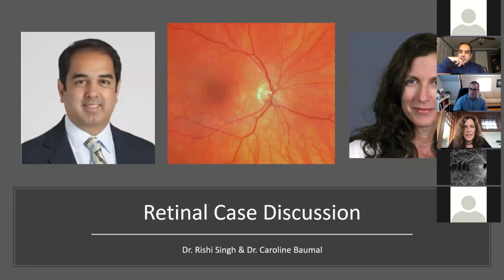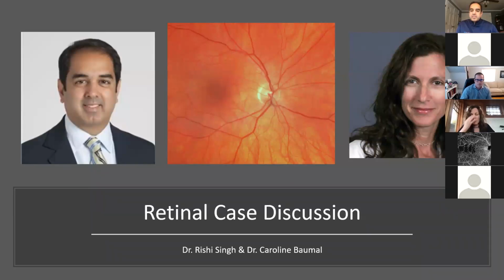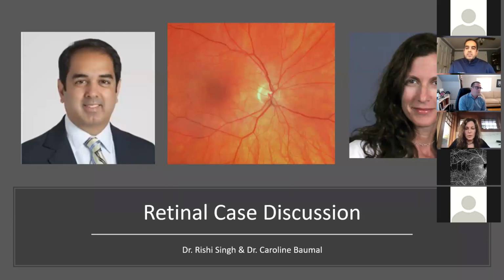Well, I think that we're definitely categorizing intraretinal and subretinal fluid differently, because that's a little bit easier to even tell just from looking. But I love the way that you looked at the sub-RPE fluid, Rishi, and I think that was great. And the one thing I really like about the way that you demonstrated in your talk, like with workplace, is that you can see the changes over time, because it's really easy to miss those small little subretinal thinnings or a very, very small developing macular hole. And I like looking at the en face and seeing how you can see the changes over time.